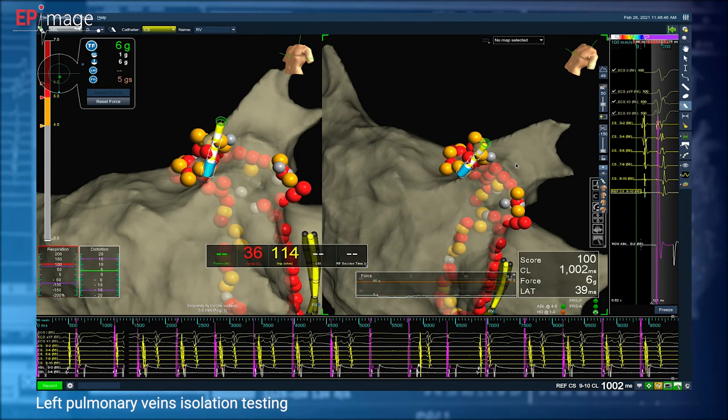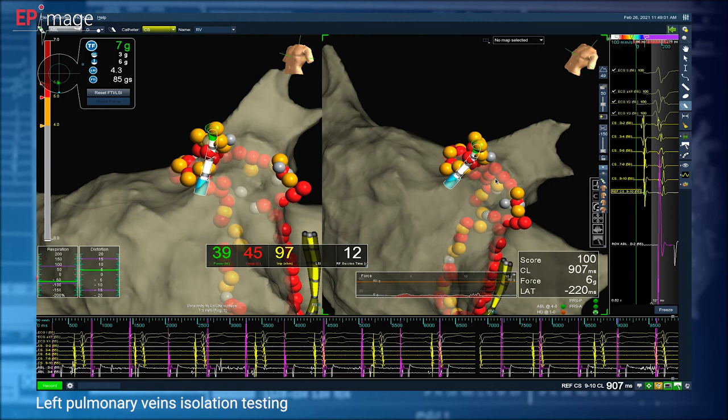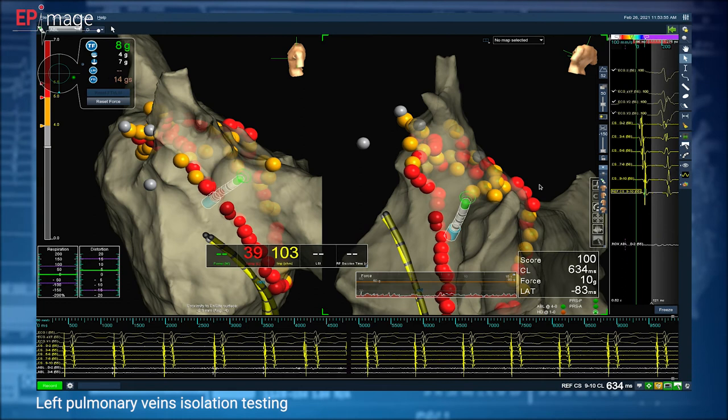It just happens, you know. Sometimes the number of applications, as you see in this patient, just around the left pulmonary veins, is even more than enough for the full isolation of pulmonary veins in other patients. But it's just our case: a patient with a huge left atrium, a patient with an ejection fraction of 29%.